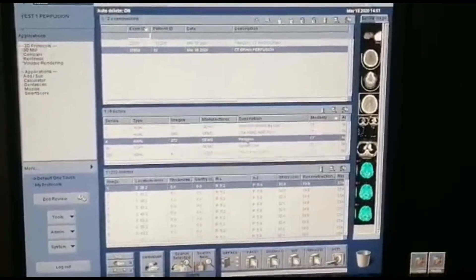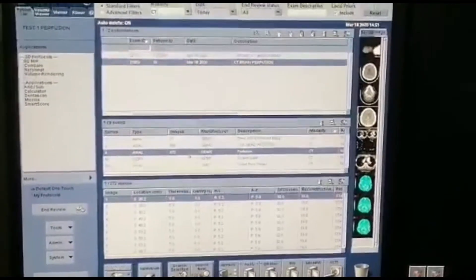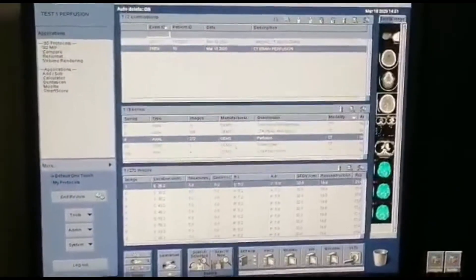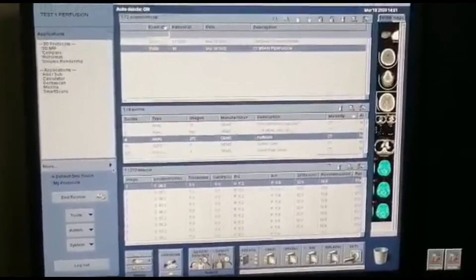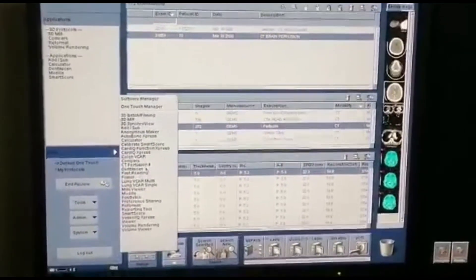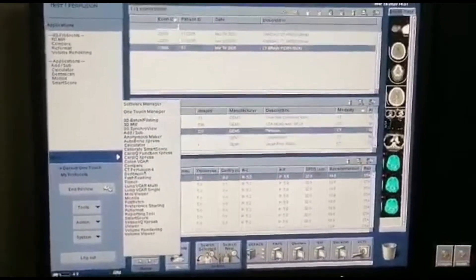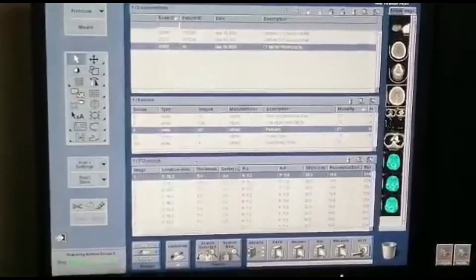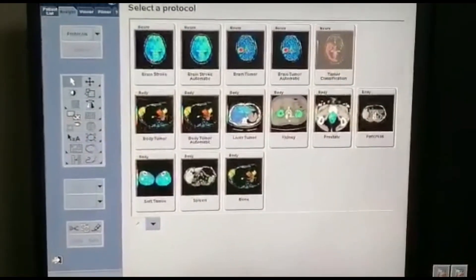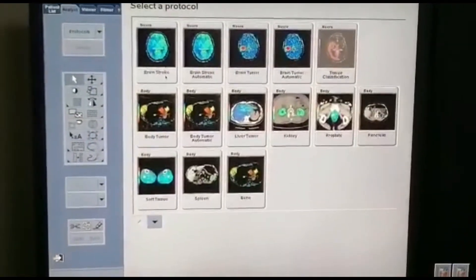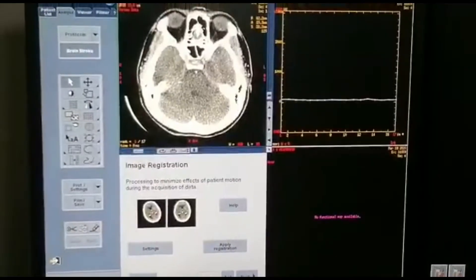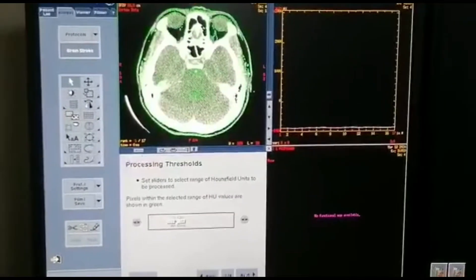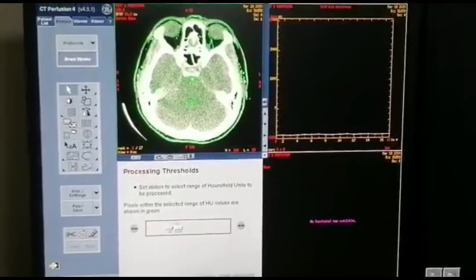Select the perfusion series — it will be under the perfusion — and then go to more. Then you have CT Perfusion 4. Select brain perfusion and then click next.